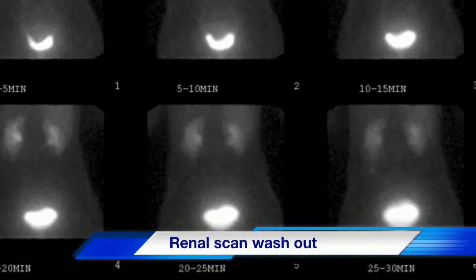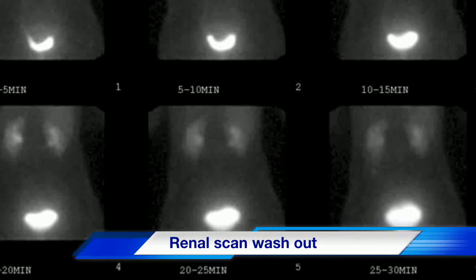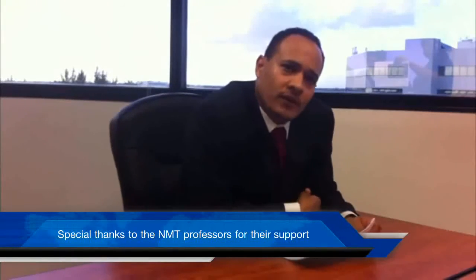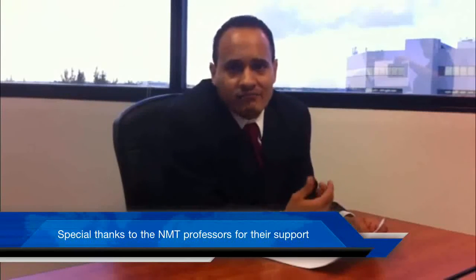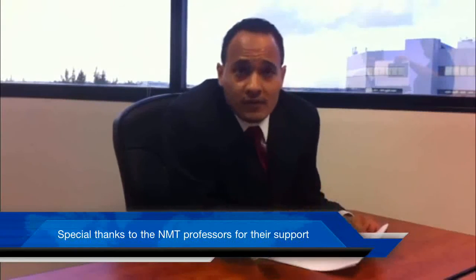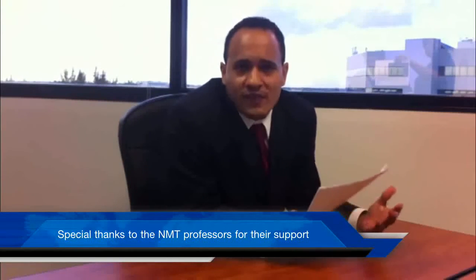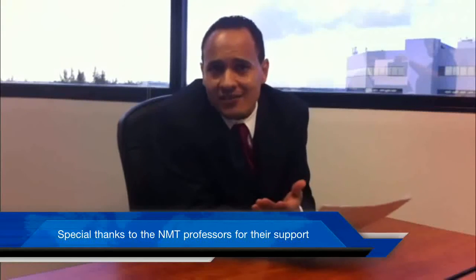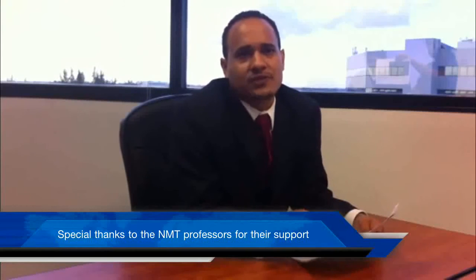Here we have a MAG-3 renal scan after Lasix administration that demonstrates no obstruction with normal response to Lasix of both kidneys. Okay, well, this has been very informative for our viewers concerned with the procedures and has shed some light on renal scans with Lasix. A renal scan, as we've mentioned, is beneficial in trying to identify the cause of kidney failure or obstruction, as well as give the patient and the doctors alike the opportunity to correct and treat the condition precisely.